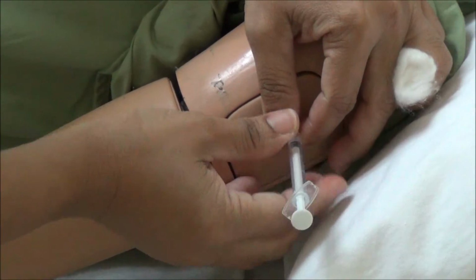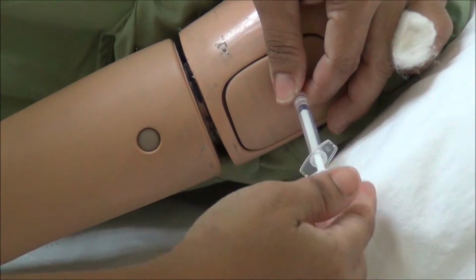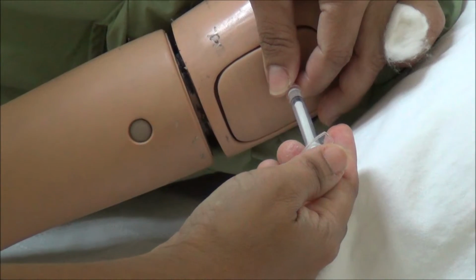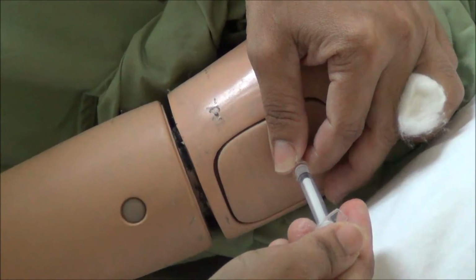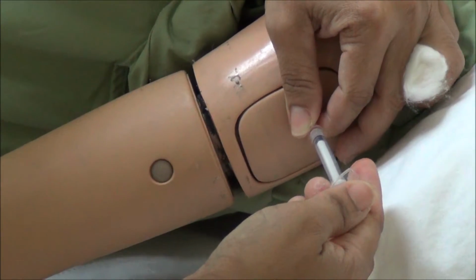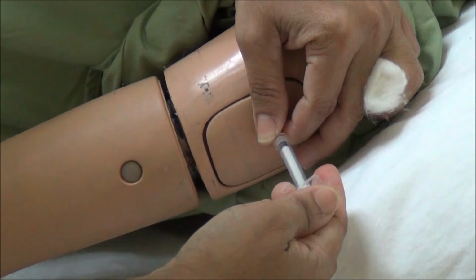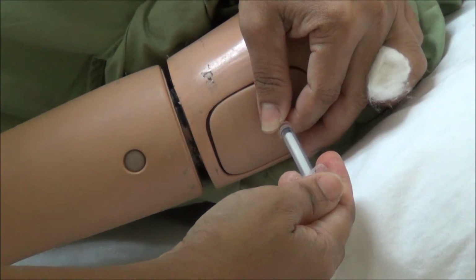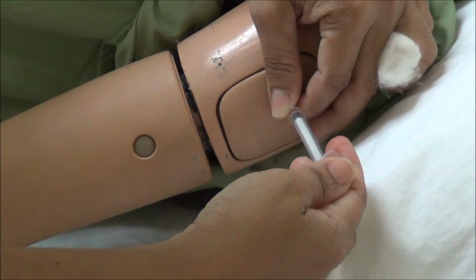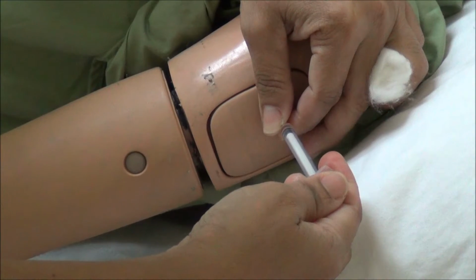Insert needle with dominant hand in a smooth and quick motion. As I said earlier, 45 degree angle if needle is 1 inch and 90-degree angle if needle is ½ inch. This is to facilitate injection into subcutaneous tissue. Quickly release skin fold and steady the syringe. Stabilize the syringe and needle with non-dominant hand.